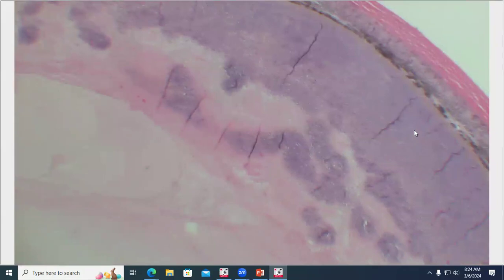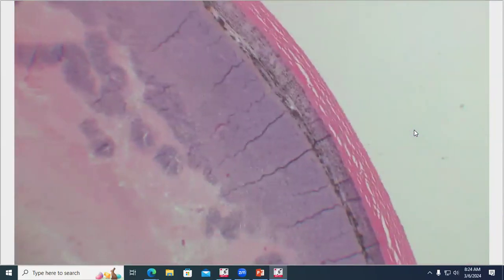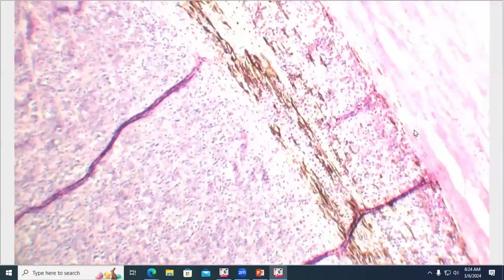And then we have more fibrin and such in the vitreous, and then we can see all that cellular infiltrate lining what is choroid, because the retina wasn't very recognizable in here. So it is detached and kind of gone and effaced by what's here. And so if we take a closer look, I liked this back area here.